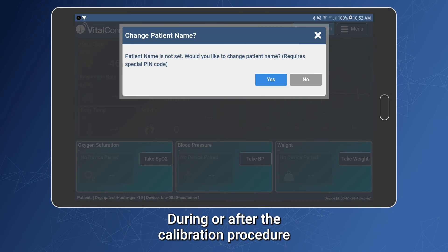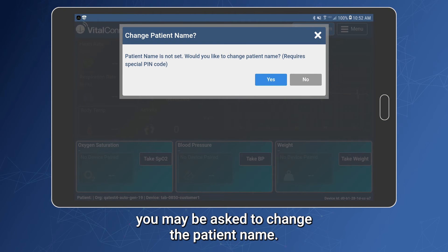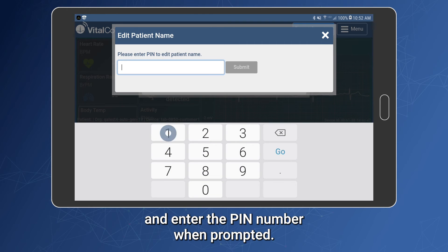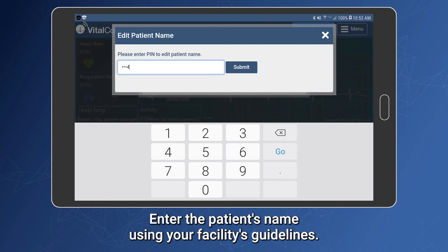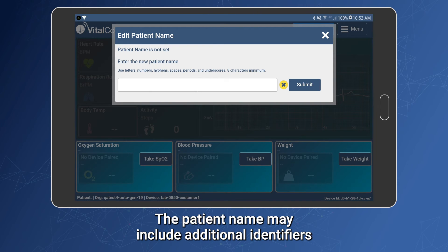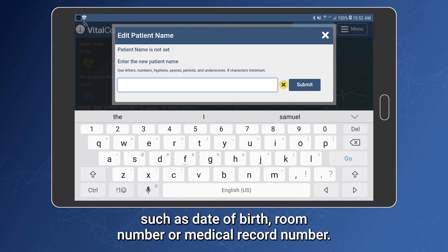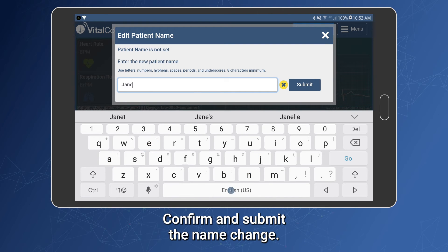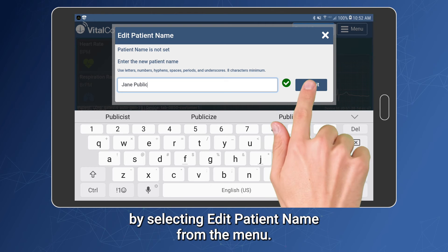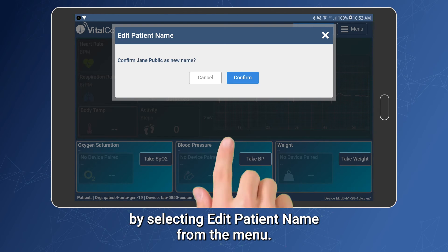During or after the calibration procedure, you may be asked to change the patient name. Tap Yes to change the patient name and enter the PIN number when prompted. Enter the patient's name using your facility's guidelines. The patient name may include additional identifiers such as date of birth, room number, or medical record number. Confirm and submit the name change. The patient name can be updated at any time by selecting Edit Patient Name from the menu.